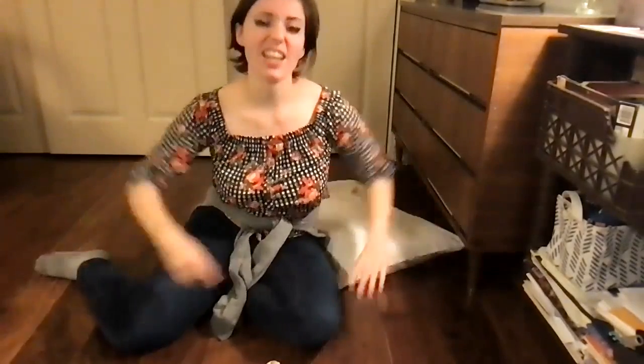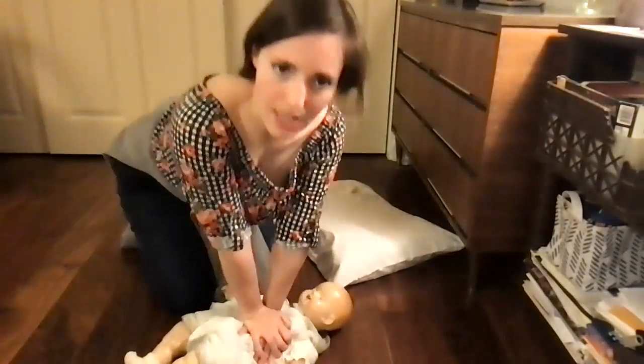So before you press that yellow button that says give shock, make sure everything's clear. Tell everybody, clear the patient. I'm clear, you're clear, everyone's clear. You're going to make sure that nothing is touching the patient. And then you administer the shock. It'll say shock given or shock administered. At that point, shock has been given, and then you resume compressions. You can resume immediately afterwards. It'll usually give a little pause and then say resume CPR. You can resume CPR as soon as it says shock given. And then you're going to go back to doing CPR on the patient.